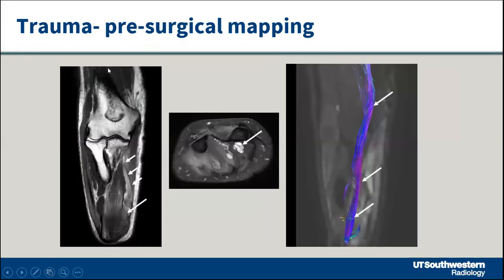Now, we are also doing pre-surgical mapping for trauma and patients who have robotic hand replacements where their nerves are connected to a robotic hand. One of our plastic surgeons has a DOD grant on that. So we image for that, and then he's looking for how far down you can see the nerve, how big is the neuroma, which nerves are preserved, which nerves look better.